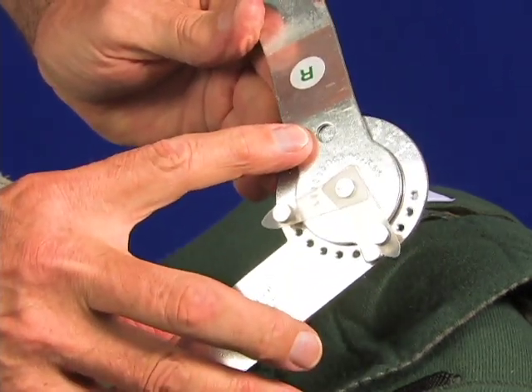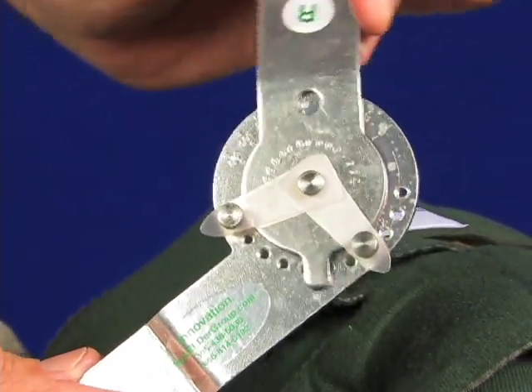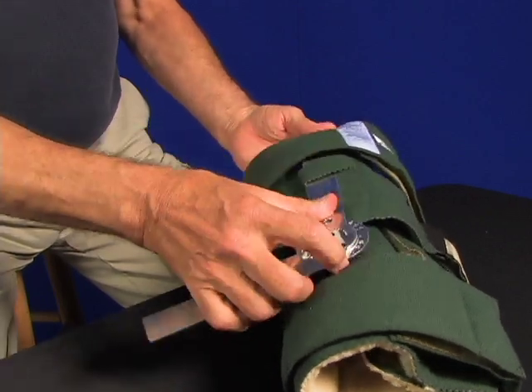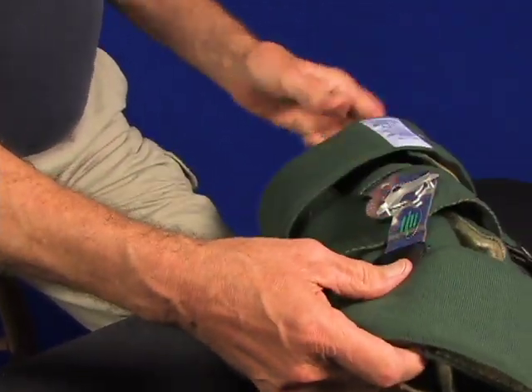You can stop it back in flexion. You can stop it at some point to counteract contractures. And you can see your degree range there in the little window. It pops into these pockets on the splint body.